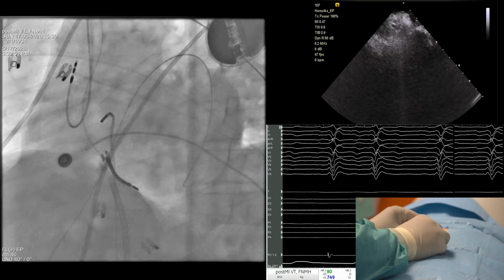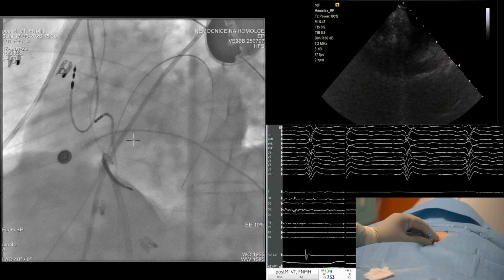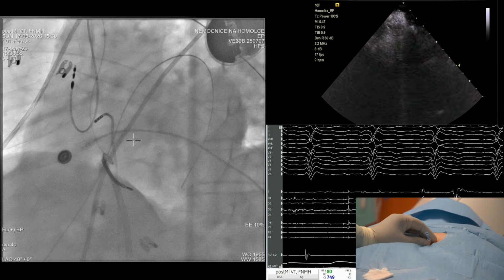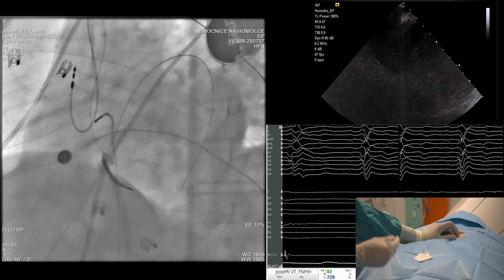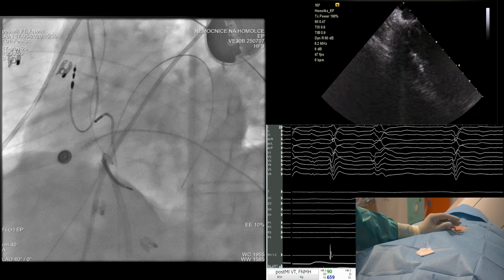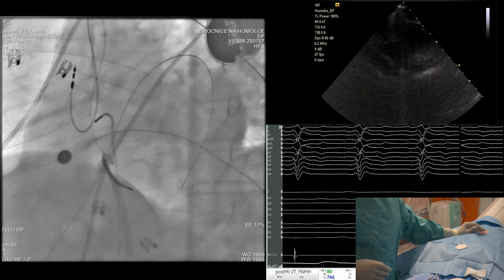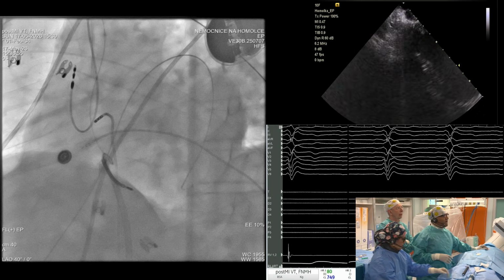Now just wire the short wire in, and then we're going to double wire the pericardium and then start mapping pericardially. So that's really all that we want to show you. So at this point, I think you can go to a different case, and then when you come back, we'll actually go through the actual clinical aspects of the case and hopefully do something interesting. So any questions on this point, or otherwise we'll go and come back.